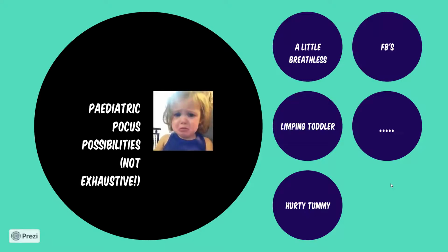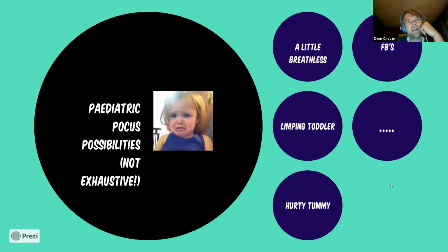Yeah, really nice case again, Dom. I think it illustrates one of the truths of PoCUS, that a lot of it is just reducing diagnostic uncertainty, just reducing your differential. Yeah, this recent one, my colleague felt that maybe it was a thigh problem, wasn't really sure, did a load of x-rays, couldn't work it out, and we found it quite quickly with that ultrasound. So it's really rewarding actually.